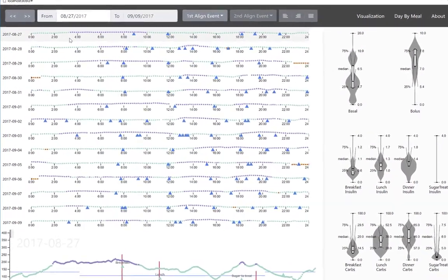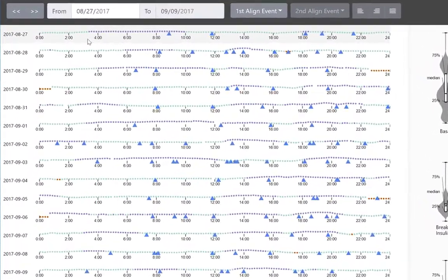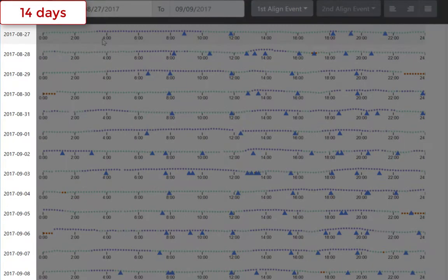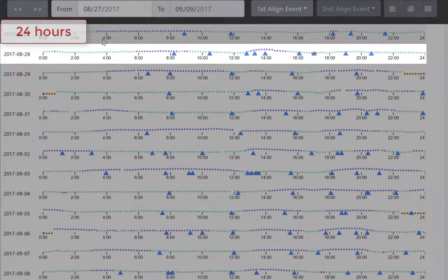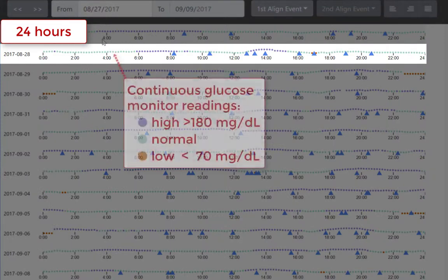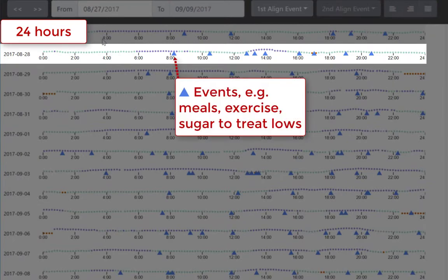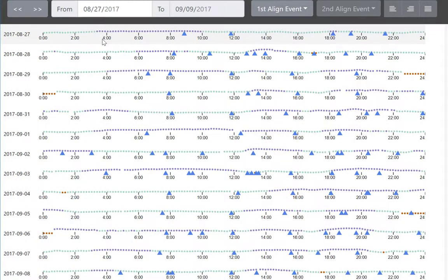Zooming in on the two-week overview, we can see rows for each day with labels along the left. Each day is a timeline of events, including dots for continuous glucose monitor readings and triangles for events such as meals, exercise, and sugar to treat low blood glucose.